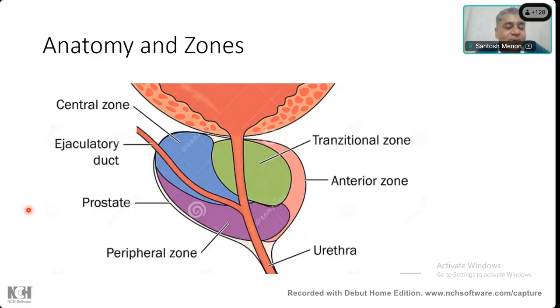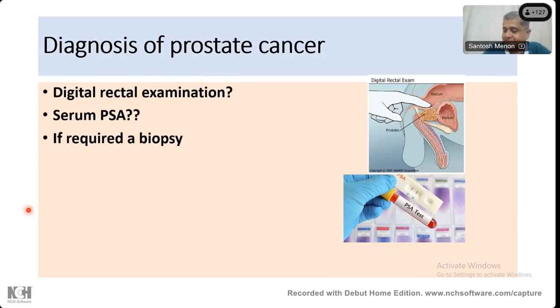So anyway, just very briefly, things like adenosis. Yes, that's a central zone phenomenon, right? Or a transition zone phenomenon. Yes. While you get some seminal vesicle change, like the ejaculatory duct, in the differential diagnosis, you're not going to see that in a TURP. That will be a needle biopsy differential diagnosis. And sometimes, like nephrogenic adenoma, again, is a transition zone phenomenon.